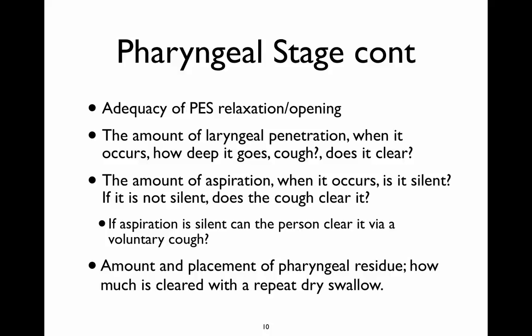If you happen to see aspiration during your MBS, you can ask the person then and there to try and clear that material that is penetrating between the vocal folds with a voluntary cough, and see if they can get most of the remaining bolus in the vestibule out of there.